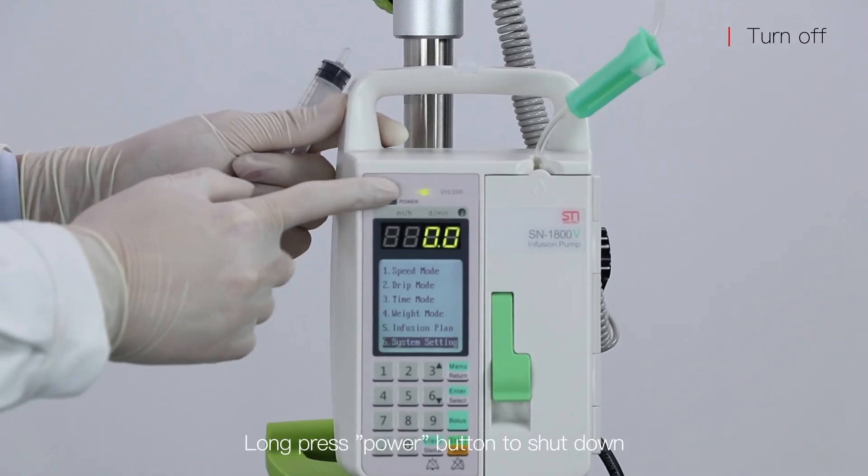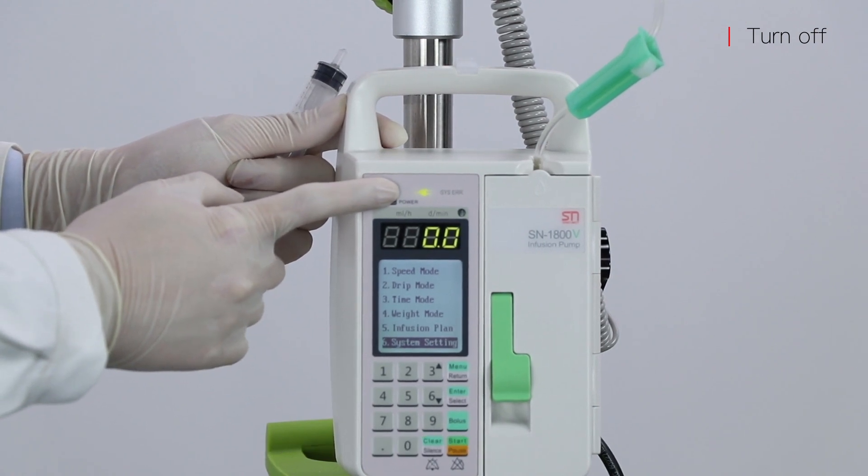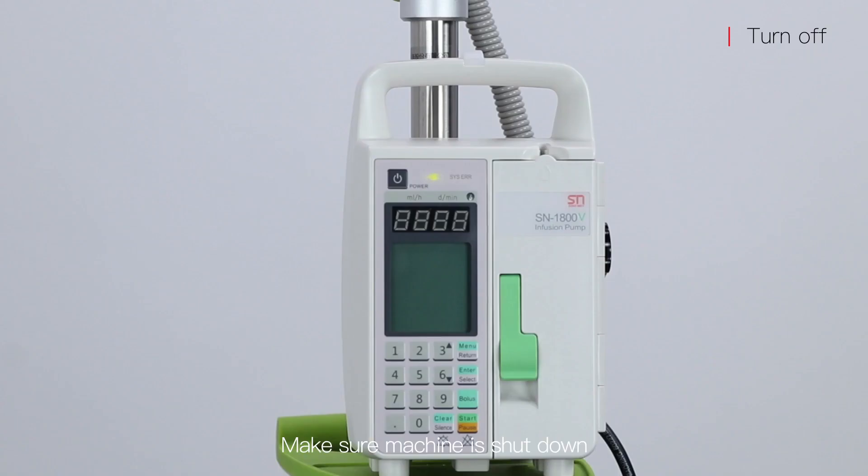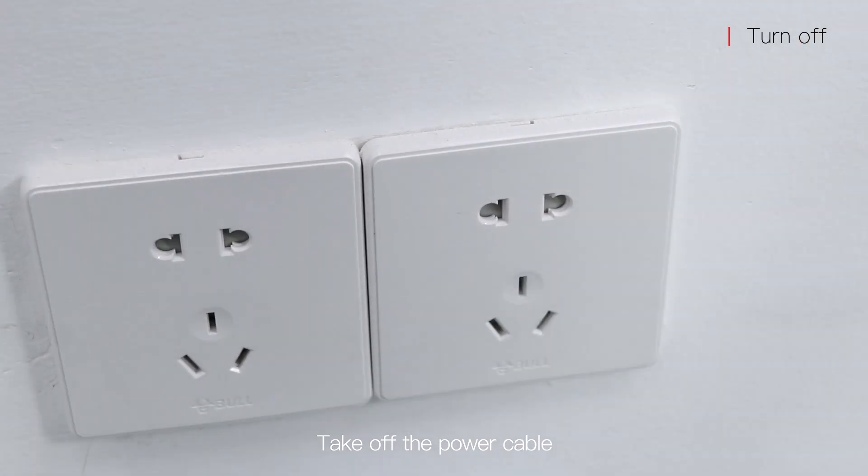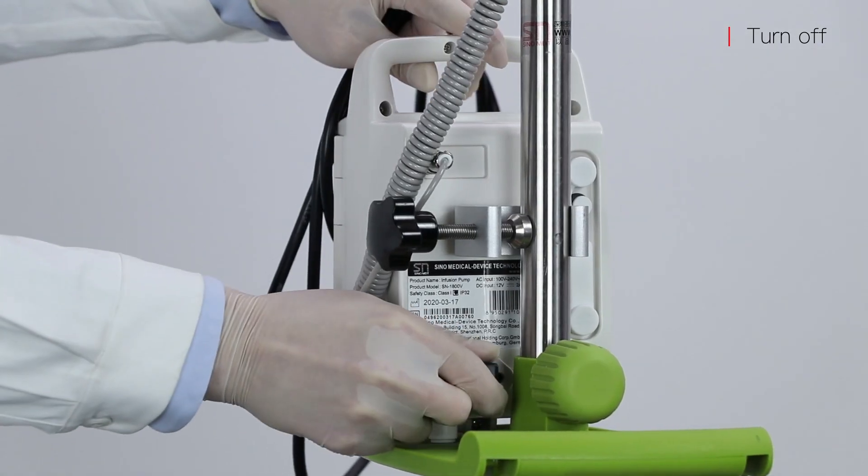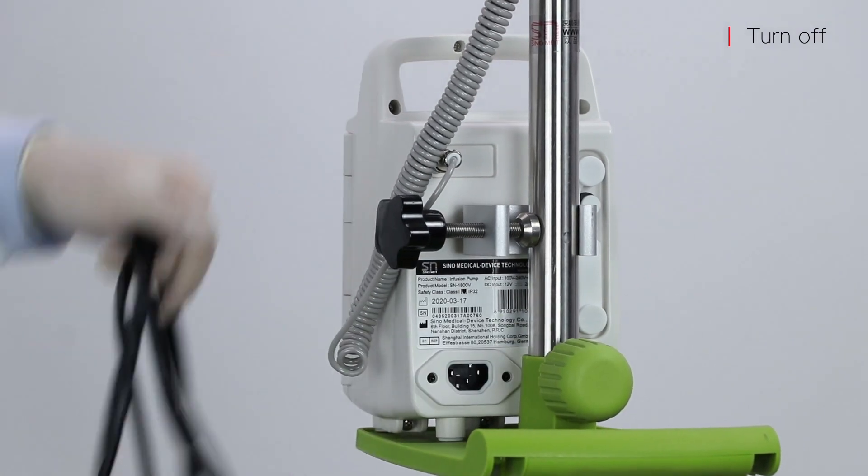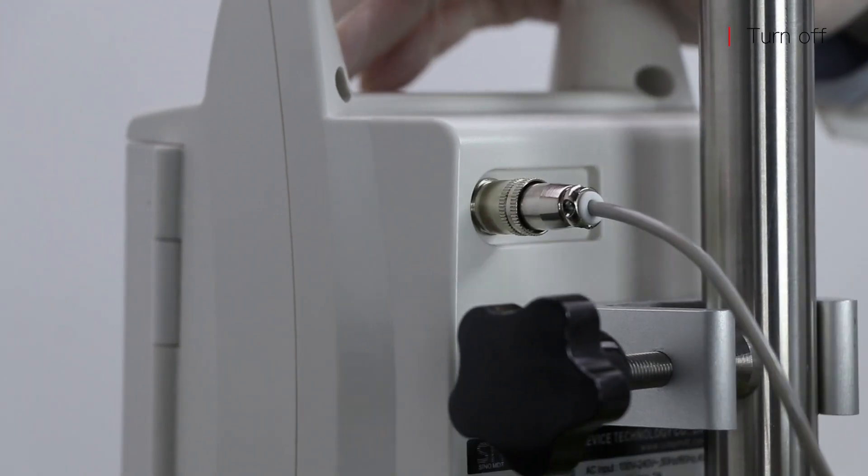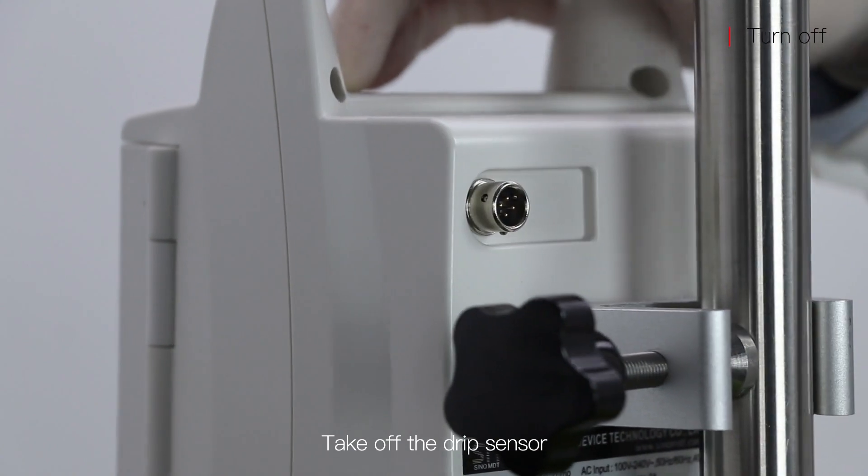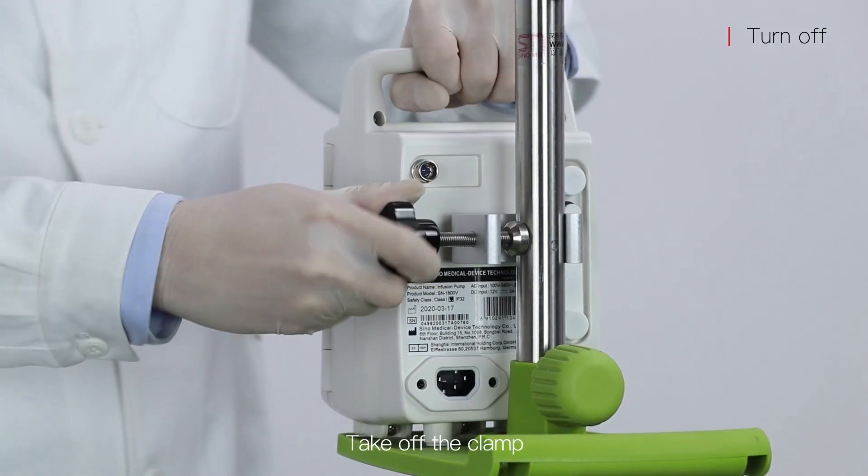Now press the power button to shut down. Make sure the system is shut down. Take off the power cable, take off the drip sensor, take off the clamp.